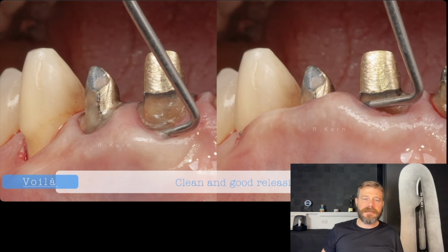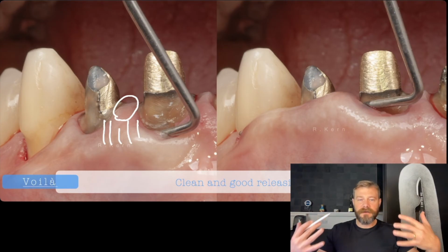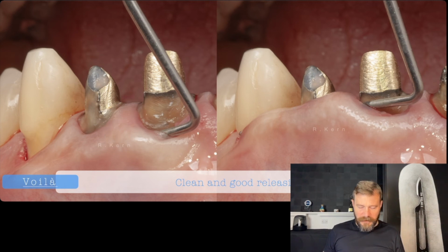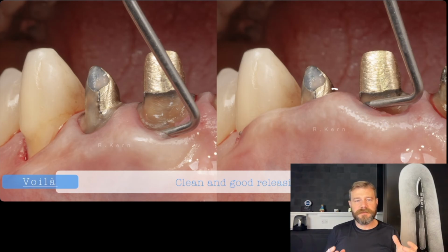Okay, so once I can really have the whole tissue free, we have used the interproximal papilla tunneling instrument. We have used the buccal papilla detachment, the sulcular detachment, the buccal detachment, and have the mucosa completely free. Look how much I can move this flap freely, even in the papilla area. It's amazing. And you're going to see the tissue is completely preserved. You see the tissue is not hurt. There's not much bleeding because of the precision of these instruments.